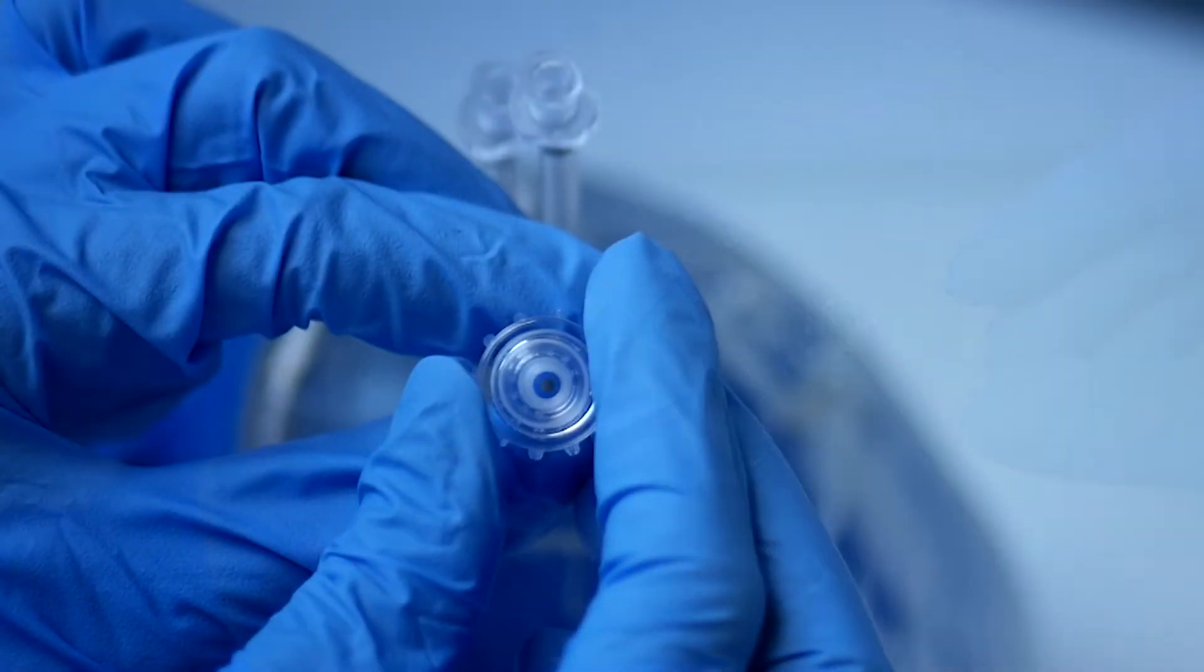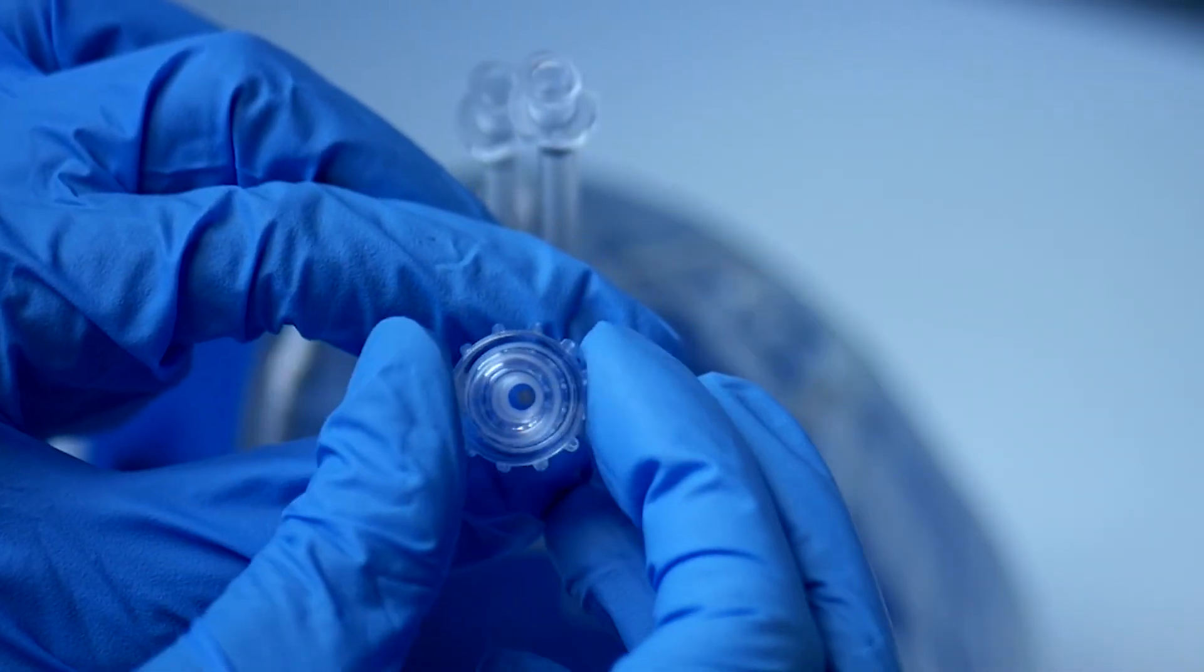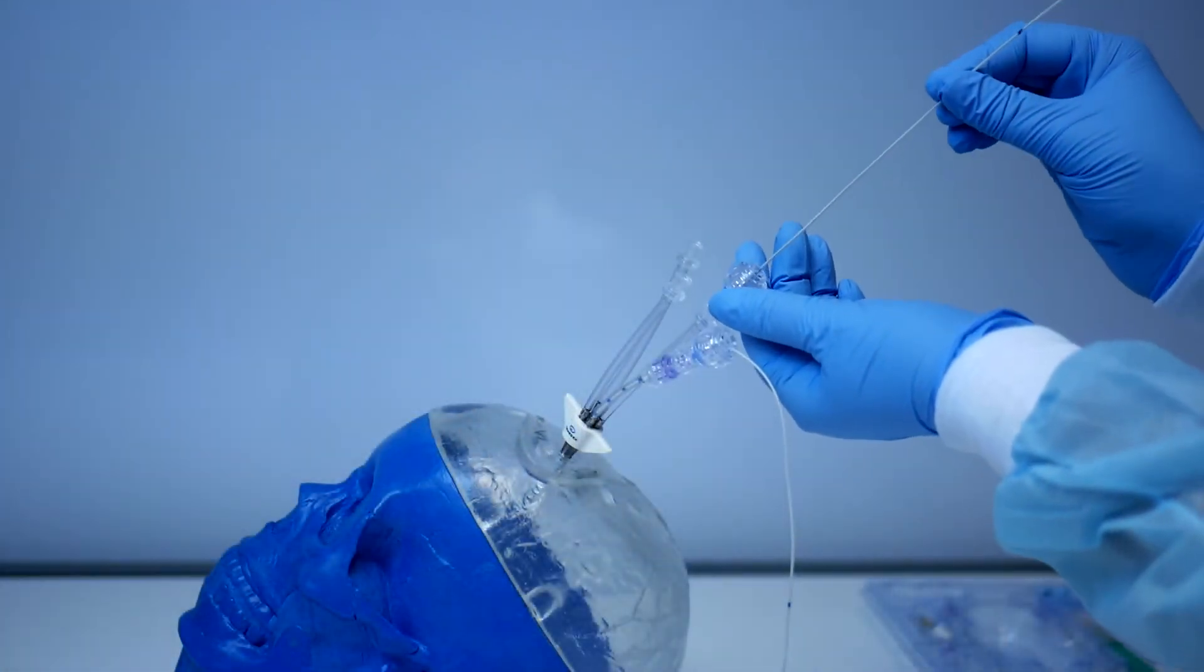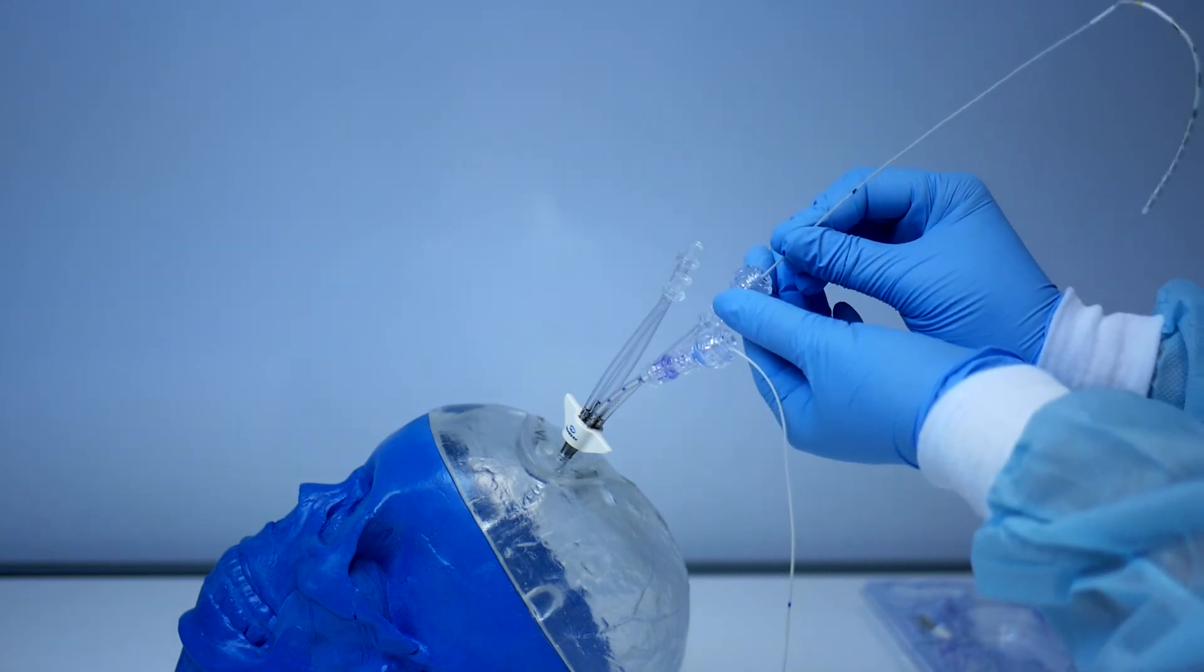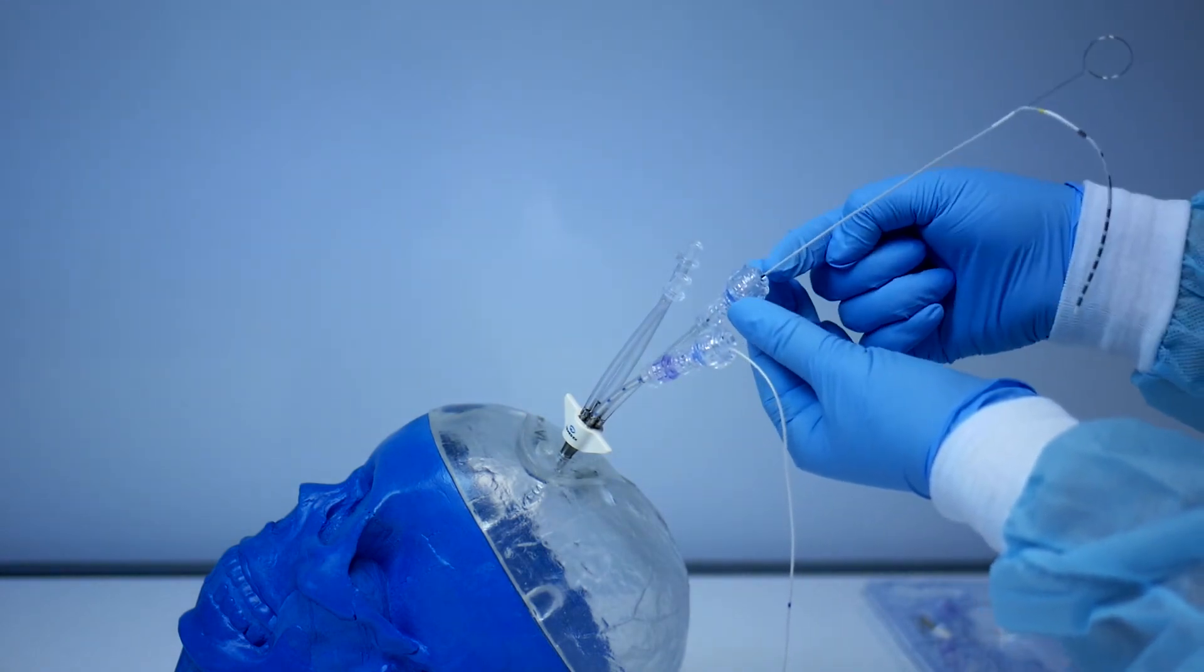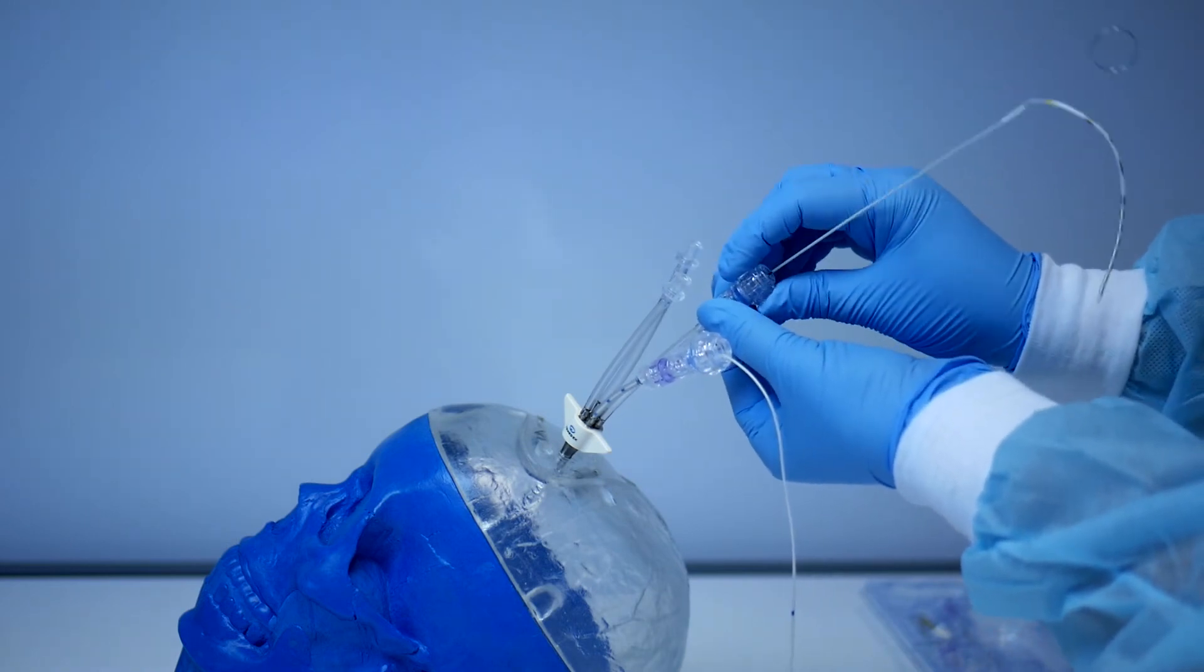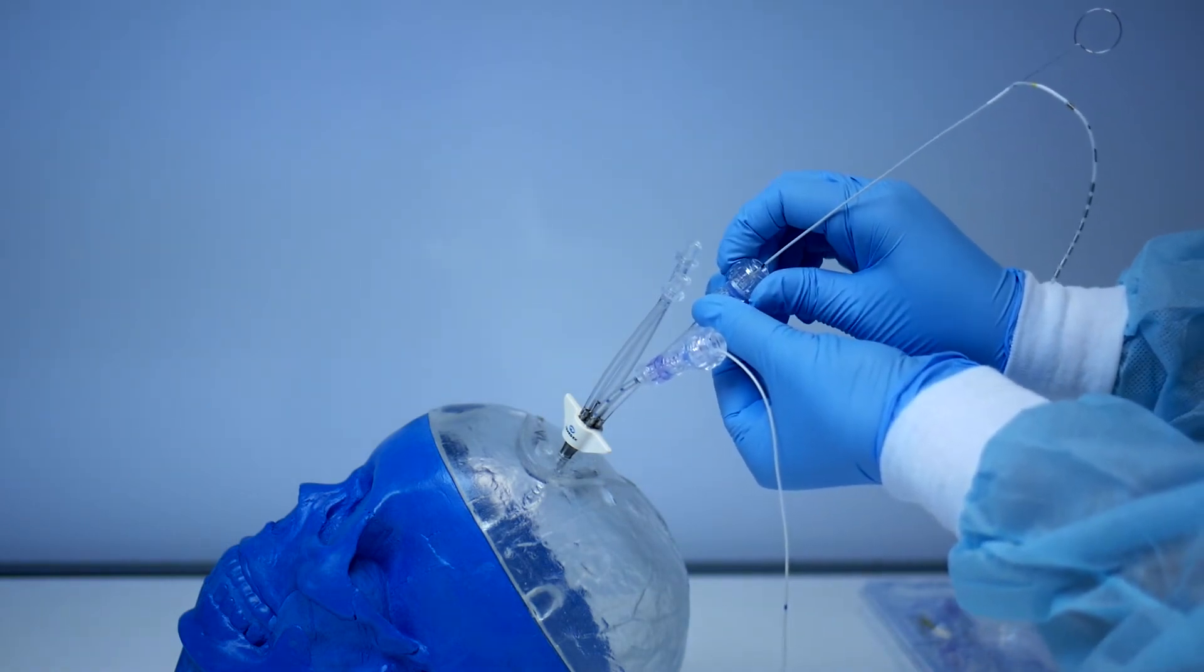Ensure the compression fitting is open. Insert the depth electrode probe through the compression fitting so that the depth marker is located at the top of the compression fitting. Turn clockwise to secure and remove the inner wire stilette.